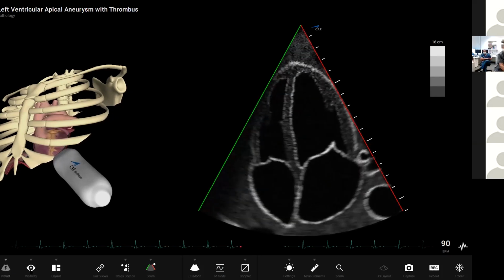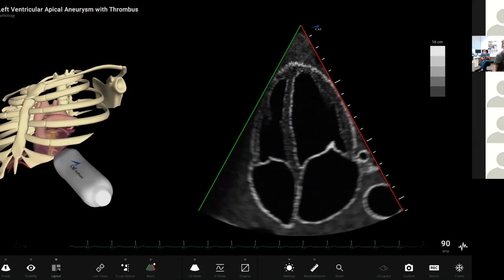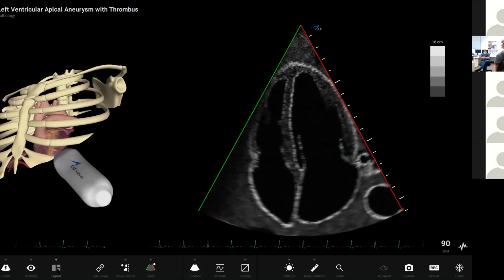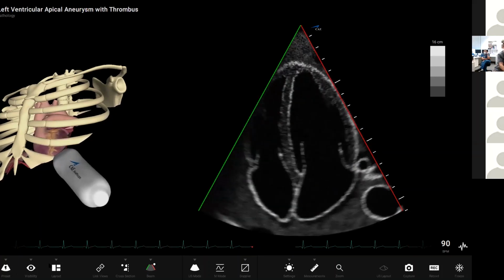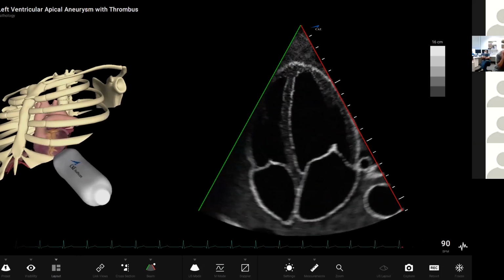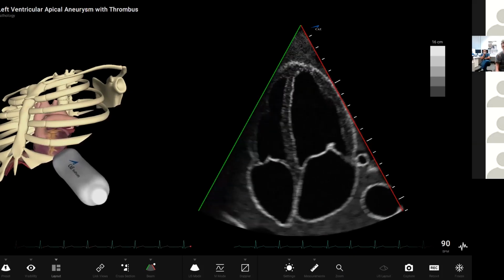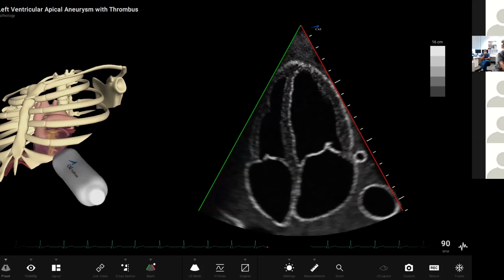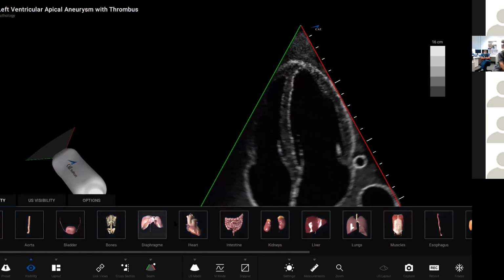Okay, this is the next little tip and trick. And again, you mentioned Iris, and I think about her every time I see this pathology. So Iris is the queen of off-axis imaging. And she's amazing. For those of you who don't know her, Iris used to be the lead sonographer. She was an amazing critical care nurse and then got into echo, working with Prof. McLean, who built the echo lab here and taught me echo. Amazing teacher. And she taught me this.